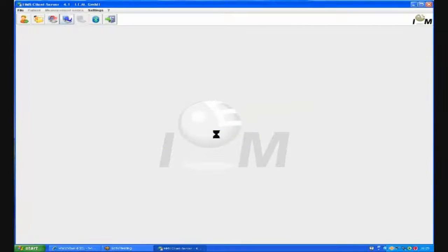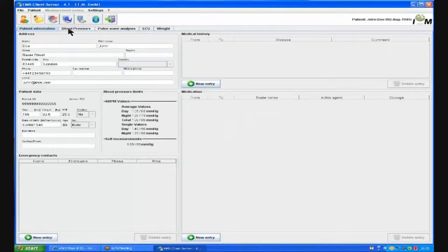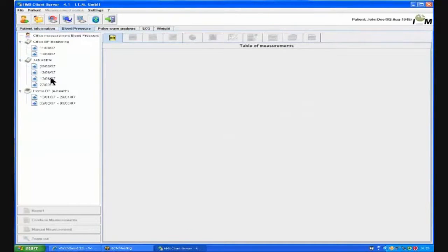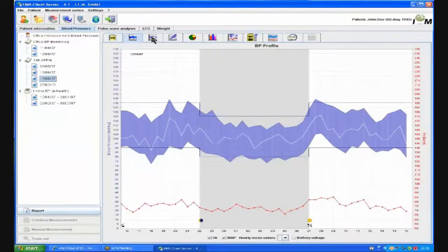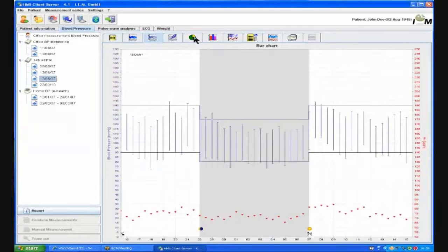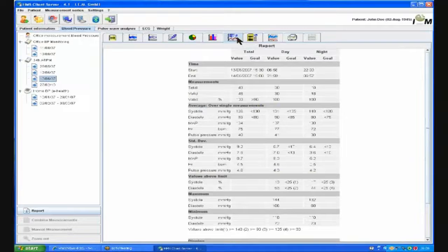Once download is complete, the patient folder will open. We can now select the blood pressure tab and select the date that the recording took place. We can now view the measurements, the profile, individual readings, and finally the statistics report, showing us all the daytime and nighttime statistics and the averages.